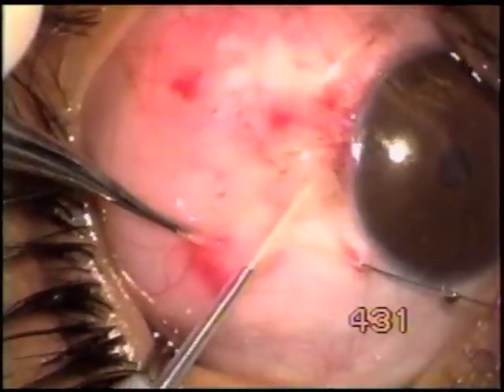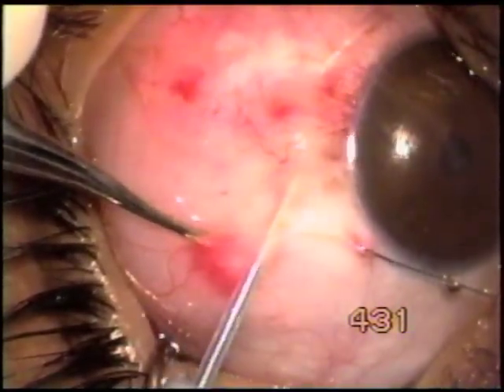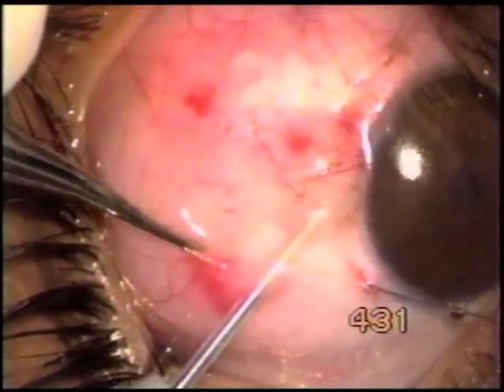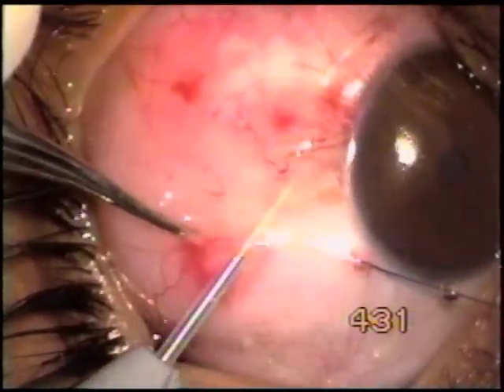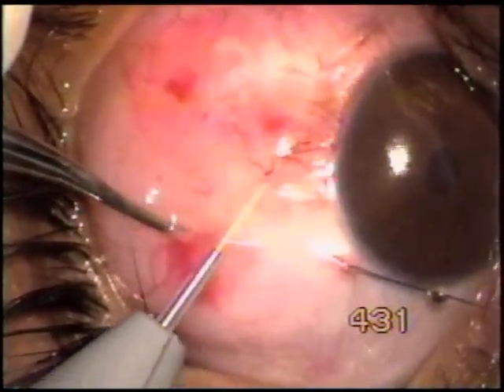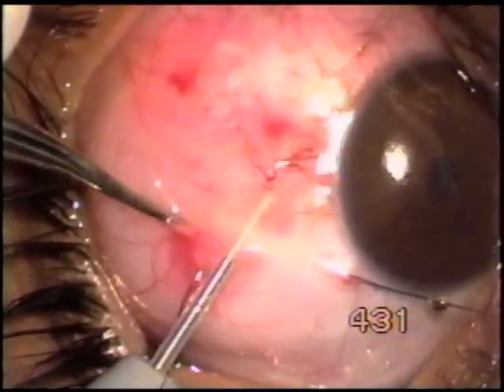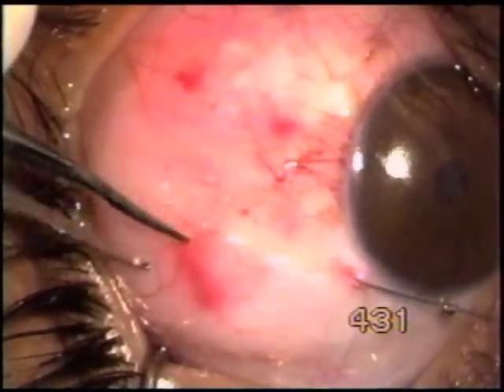Here I'm injecting sodium hyaluronate to make space for the incoming tip, which is now constantly activated and is moving under the conjunctiva to remove some of the lesion close to the limbus.